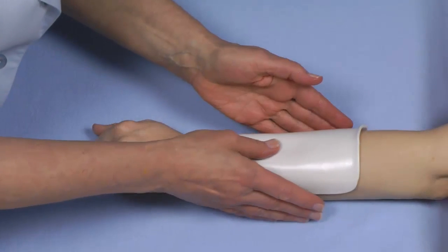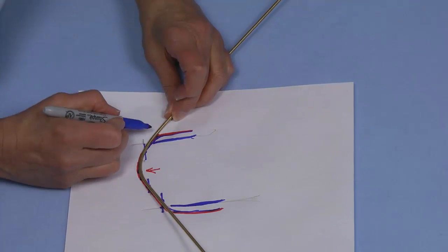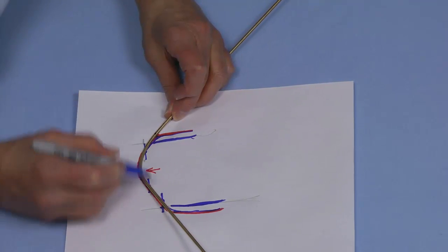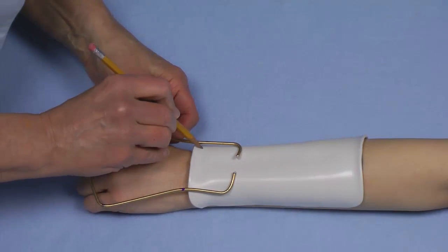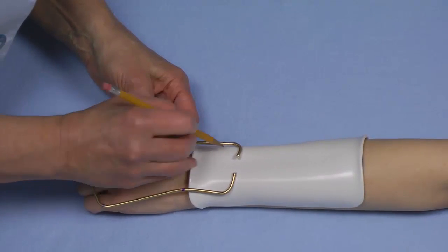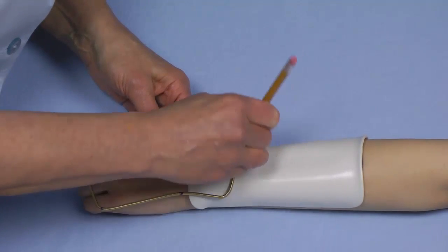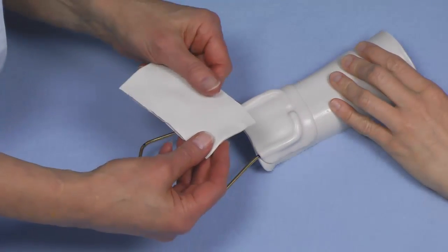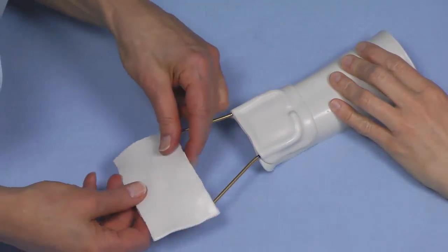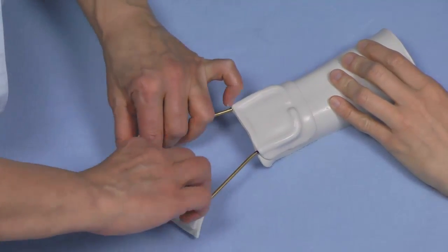I want to leave it alone and let it cool on her. Now I will mark exactly where this needs to bend. I'm going to hold it in the ideal position while I take a pencil and specifically mark where the outrigger is. Here I have a scrap of thermoplastic material that I've thoroughly heated and I'm going to drape it over this distal crossbar.